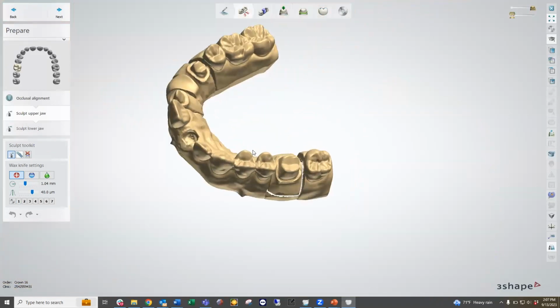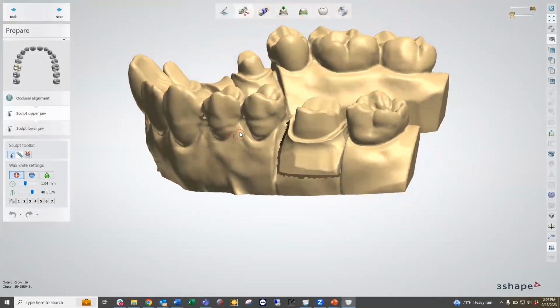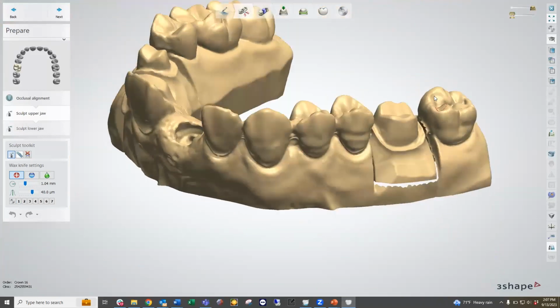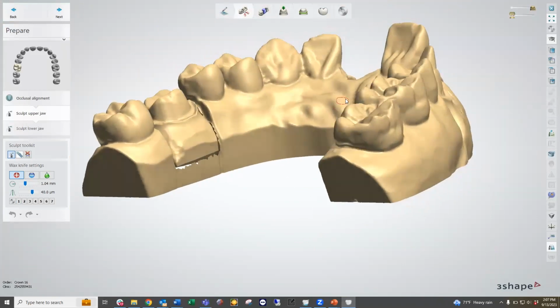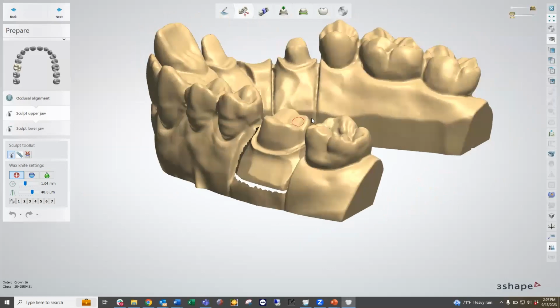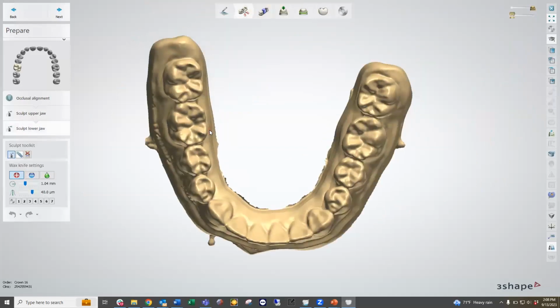So if I'm looking at this case, I really wouldn't want to develop anything over here since nothing's going to be happening over here. But we're just looking at the areas that are really crucial to our design and just seeing if there's anything interrupting or impeding on our design that might be an issue. So we can go ahead and address that as needed if we need to, or seeing that this one is okay, we can move on to the next case, which is sculpting the upper jaw.